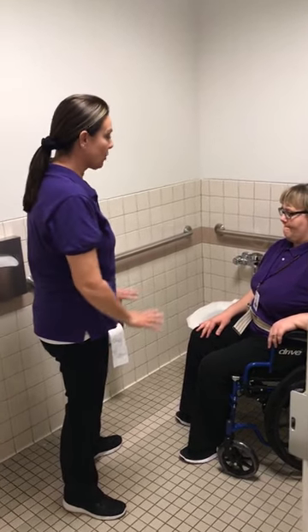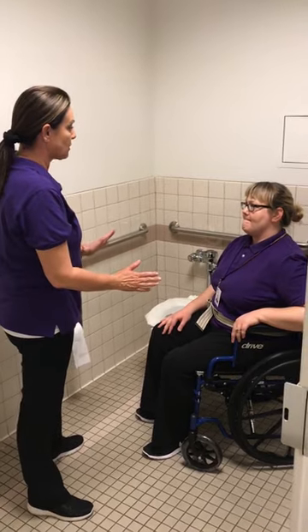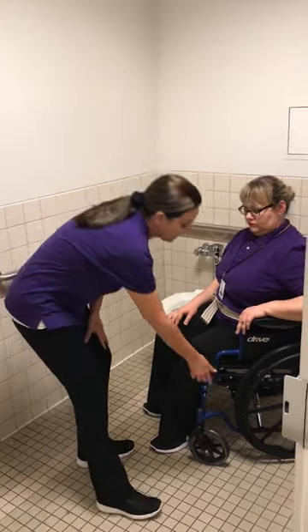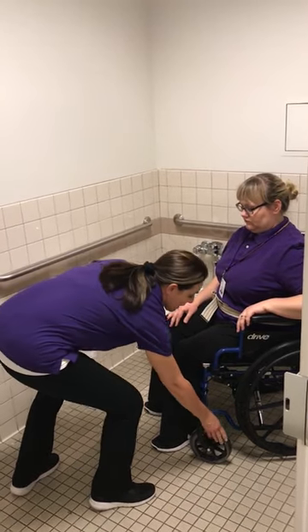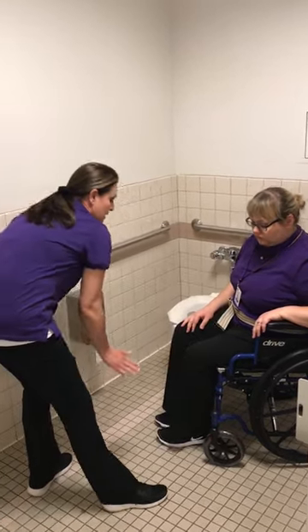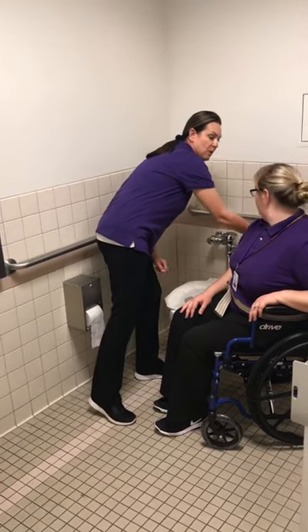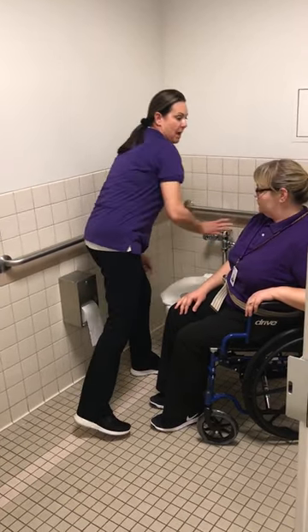So the first thing that we do before we even start the transfer is we always want to make sure that everything is locked in a safe position. We already have our wheelchair brakes locked, we have our wheels facing back, the leg rests have been removed, and I took this armrest on the right here and flipped it back.